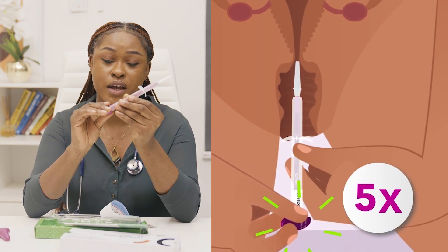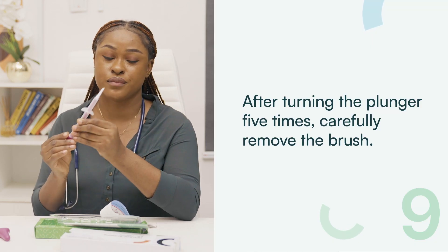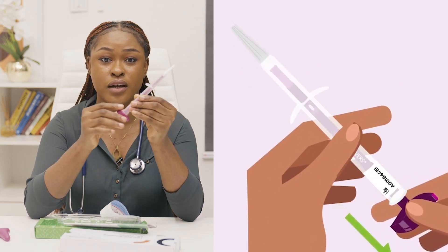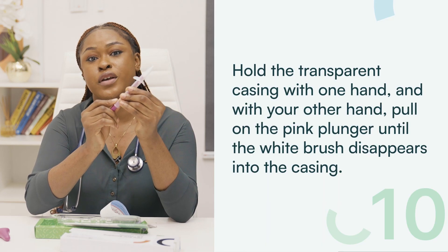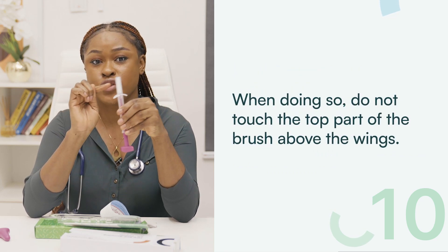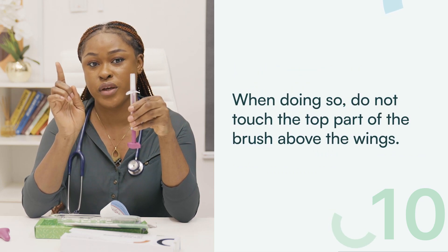Step 9: After turning the plunger 5 times, carefully remove the brush. Hold the transparent casing with one hand and with the other hand, pull the pink plunger until the white brush disappears completely into the casing. Remember not to touch the top part of the brush above the wings.